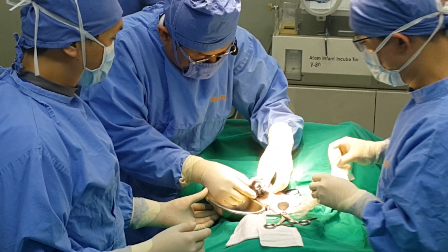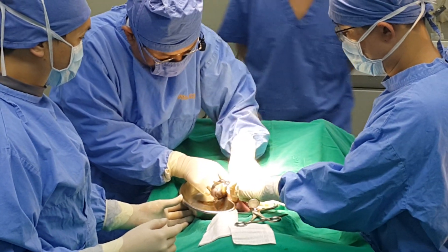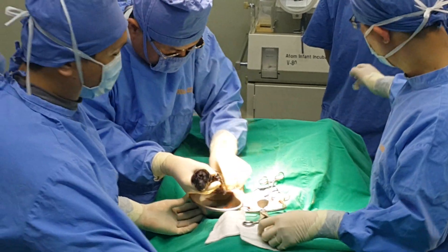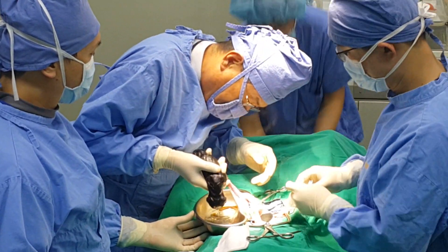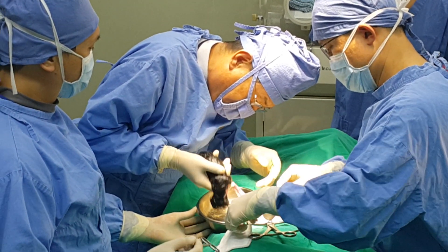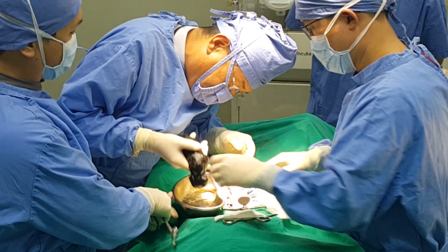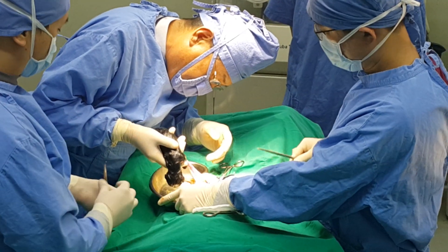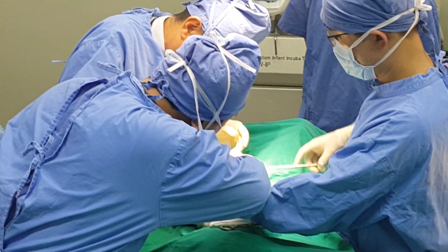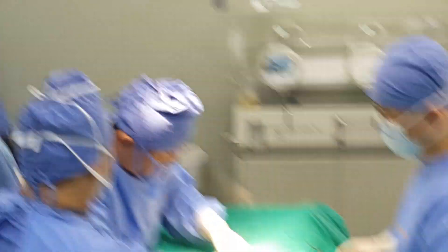They're opening the sack now and taking out the puppy. That's a $100,000 Dachshund. Happy birthday! Right now they're cutting the umbilical cord and taking the pup into the incubator, while Professor Pupin is extracting the placenta.